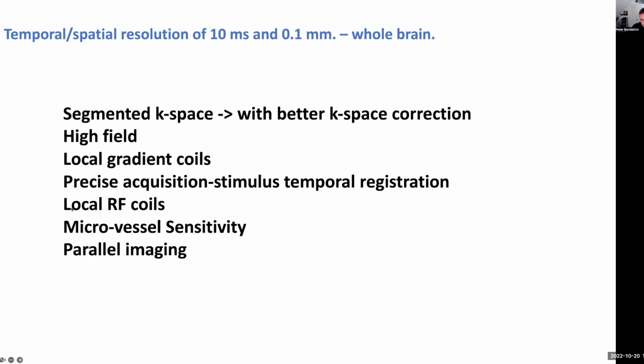We can do most of that. Certainly local RF coils, and local shim coils would be important as well. I think, once again, MGH is pioneering using the RF coils as shim coils. That's a clever idea.